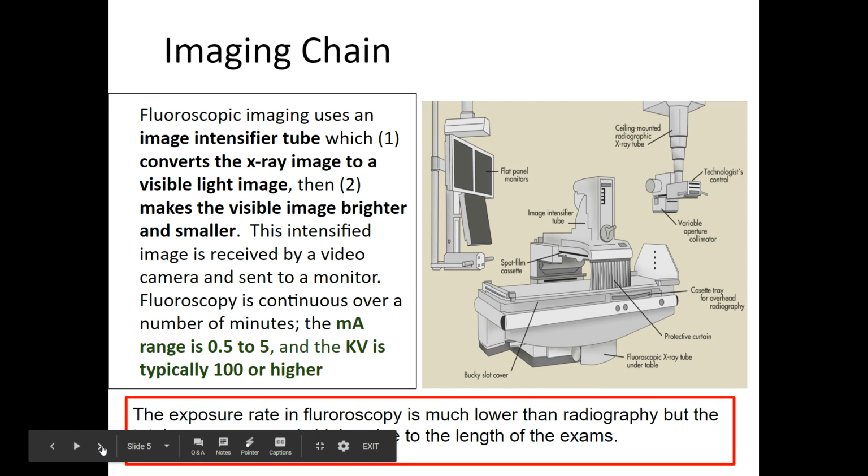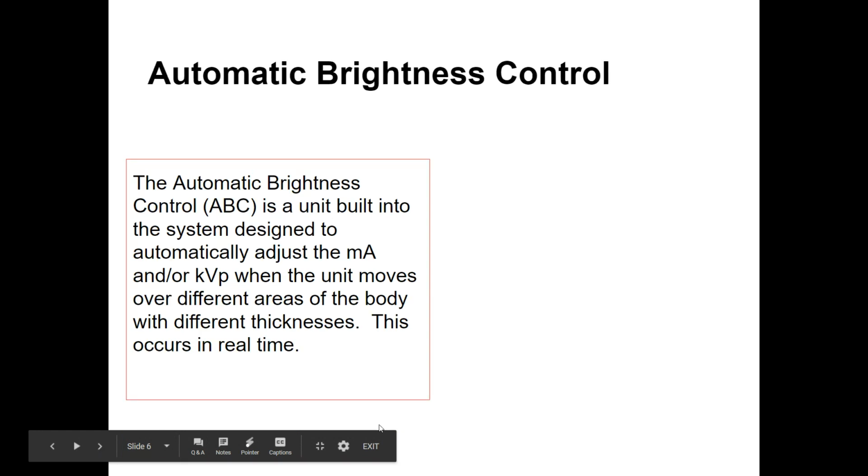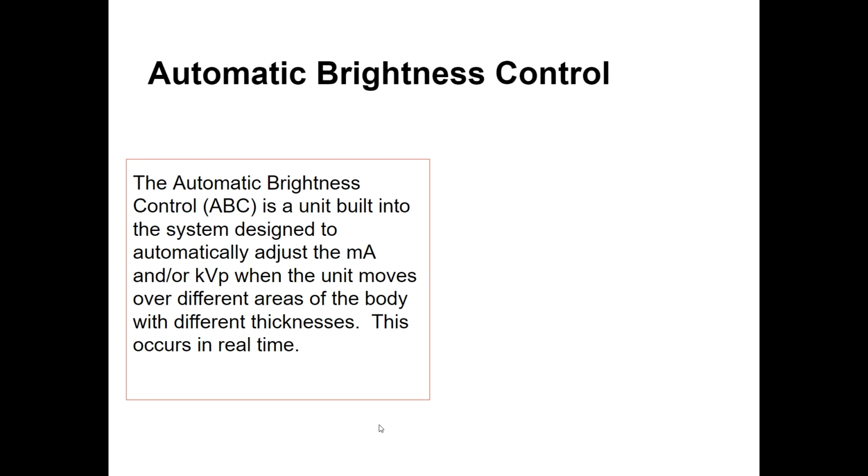But ALARA, guys, we try to be as low as reasonably achievable, right? Benefits outweigh the risks, right? We try not to do fluoro on pregnant patients unless it's an emergency.